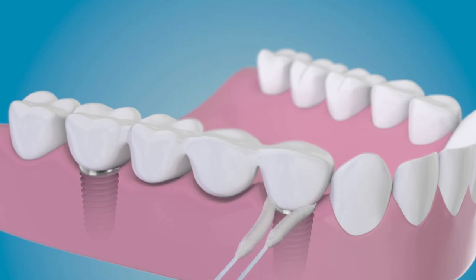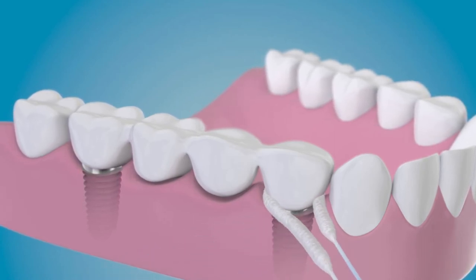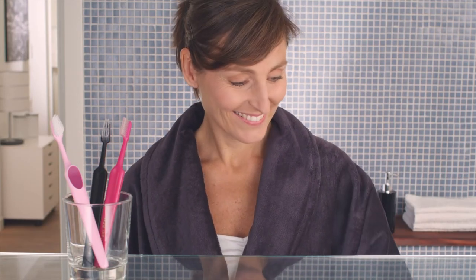Wrap the floss against the tooth, implant, or prosthesis and move up and down a couple of times to remove plaque. The floss is wide and spongy for efficient cleaning. This is a one-time use disposable floss.